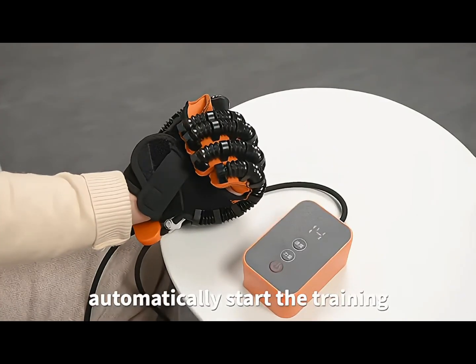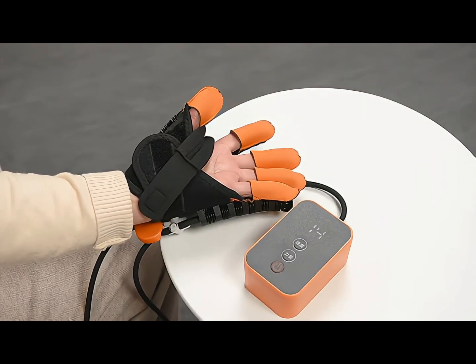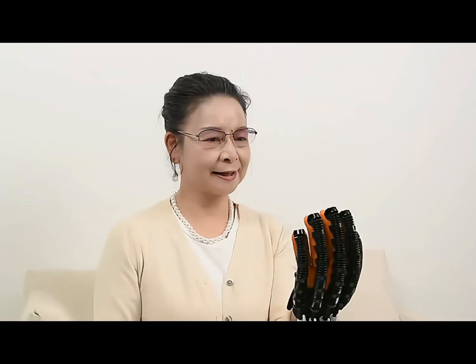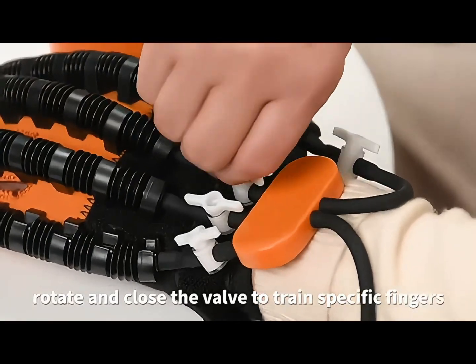Automatically start the training. Speed and strength can be adjusted. Rotate and close the valve to train a specific finger.